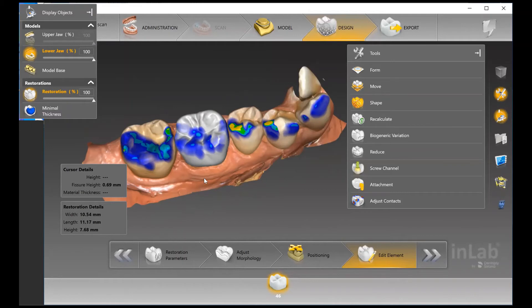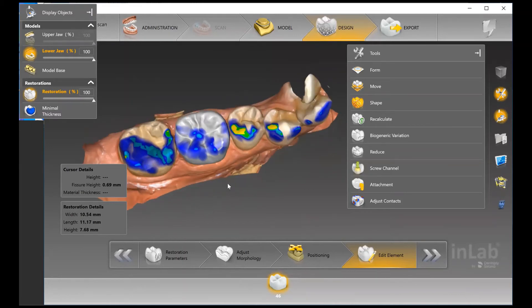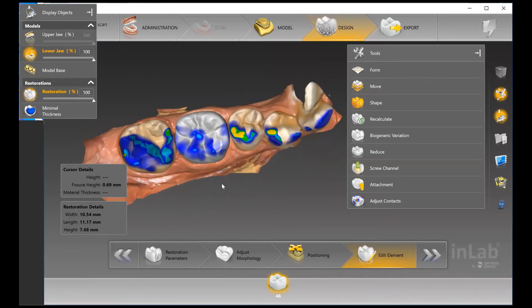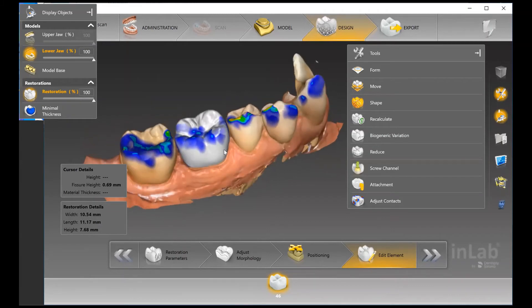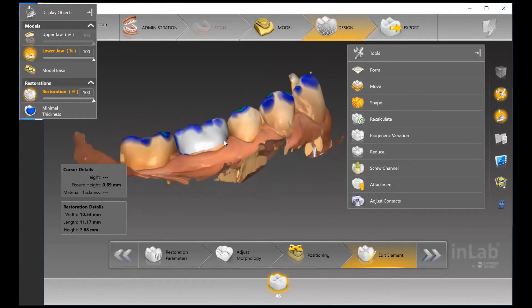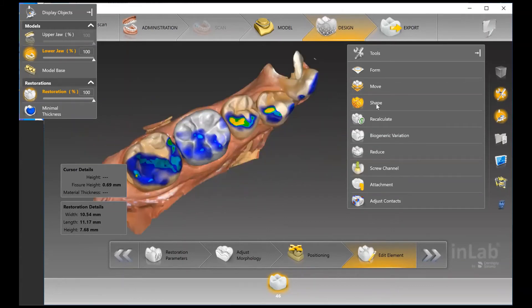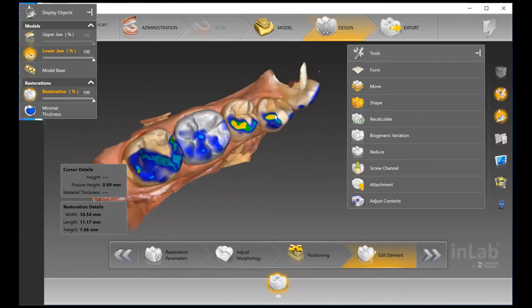The color markings we're seeing are the contact points. We can already tell that this patient probably has a little bit of a heavier bite, just based on what we're seeing on the premolars. But at this point we're able to make any adjustments should we need to.